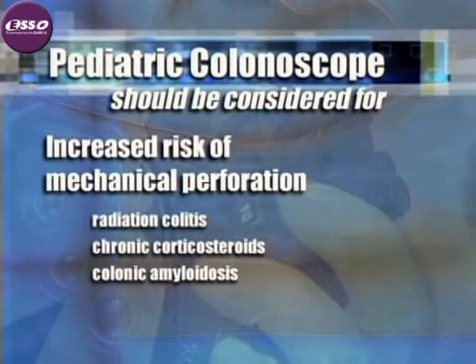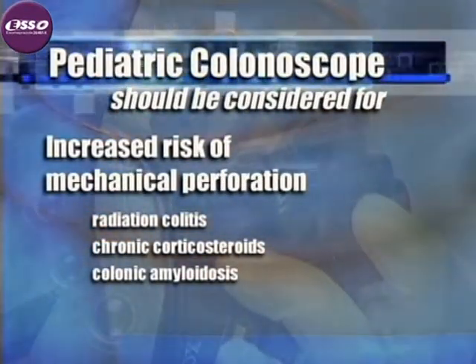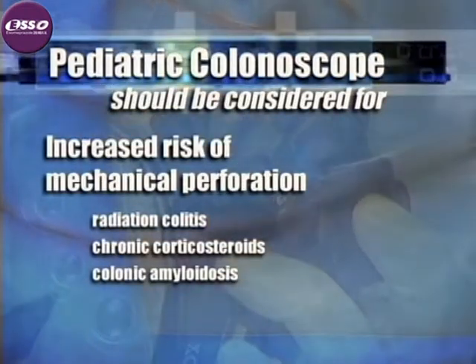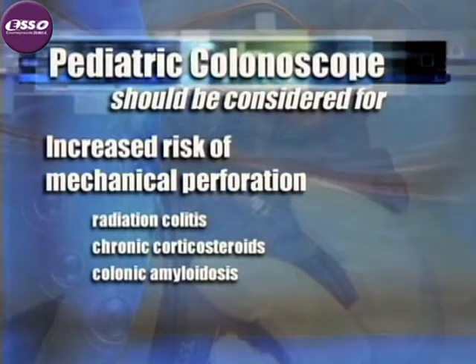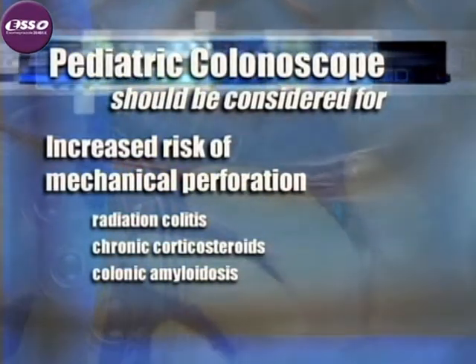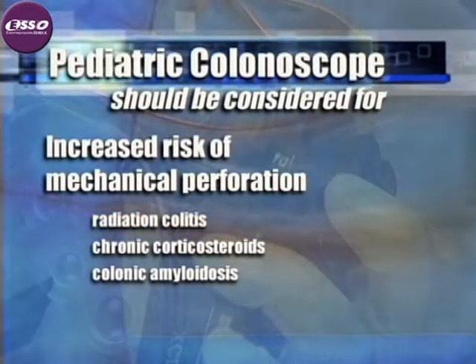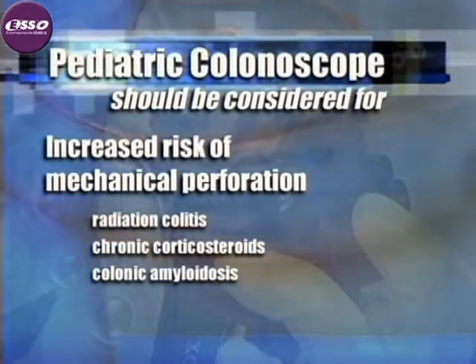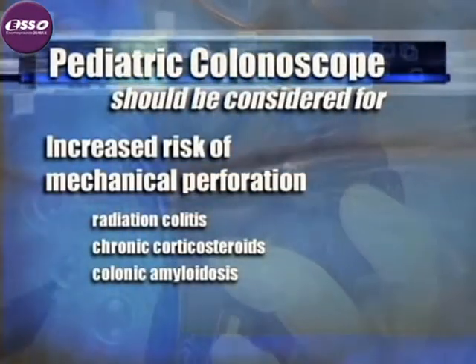The pediatric colonoscope should also be selected when you know there is an increased risk of mechanical perforation. I include here radiation colitis, patients on chronic corticosteroids, and those with known colonic amyloidosis. The colon is more fragile in these settings, and the reduced forces associated with a pediatric colonoscope will likely reduce the risk of mechanical perforation. In fact, if you are using a pediatric variable stiffness colonoscope, I recommend not activating the stiffener when colonoscopy is performed for these indications.